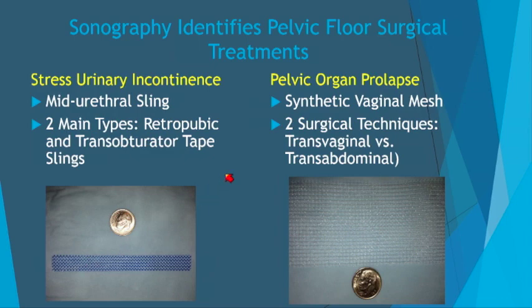In pelvic organ prolapse, because the organ involved generally requires a broader area of support, now you're talking about material which is what we call mesh material, which is this here. And the shape of that mesh depends on the organ involved. This mesh is extremely thin. If you actually feel it, it feels like one layer of gauze.